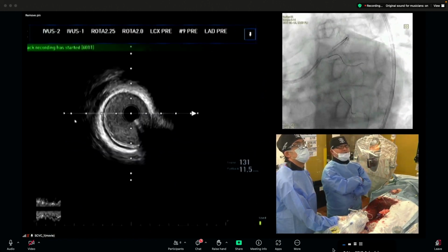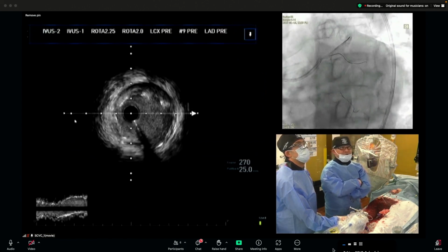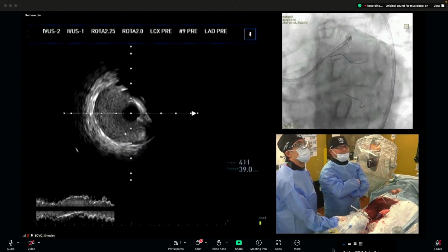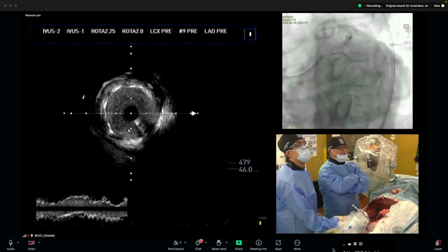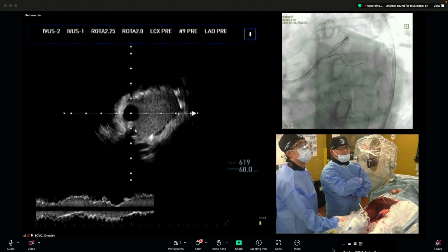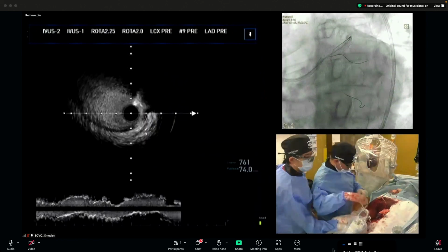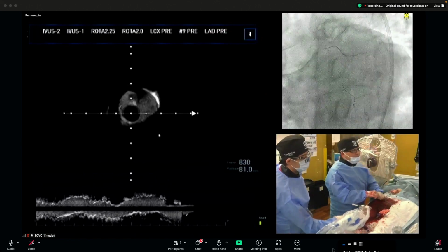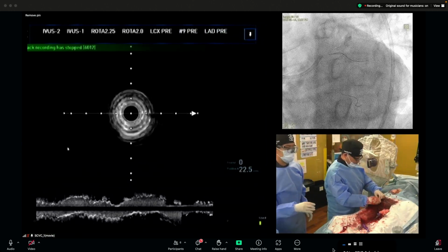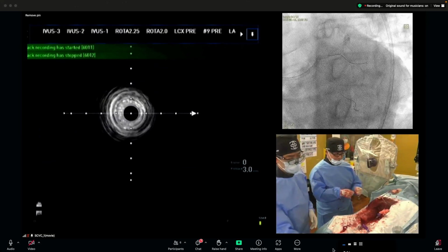Of course, this is the proximal part before the optimization. This is the distal. Okay, Kuramichi sensei, please. Okay, this is the IVUS. So after stenting, the stent is well expanded. So this is the diagonal branch, maybe, and this is the proximal part. The stent position looks nice, and of course we need a post dilatation POT for the left main, and also proximal already. Please stop at the LAD diagonal bifurcation. I would really like to see that.